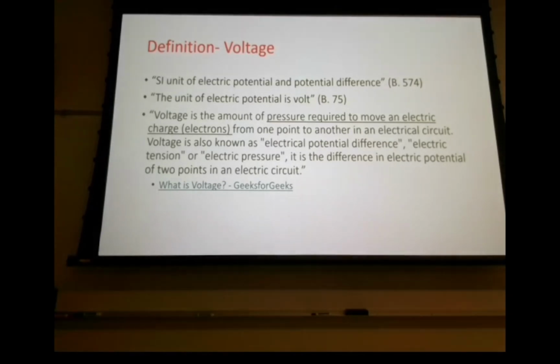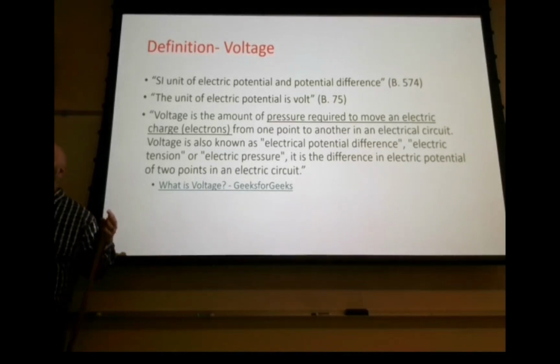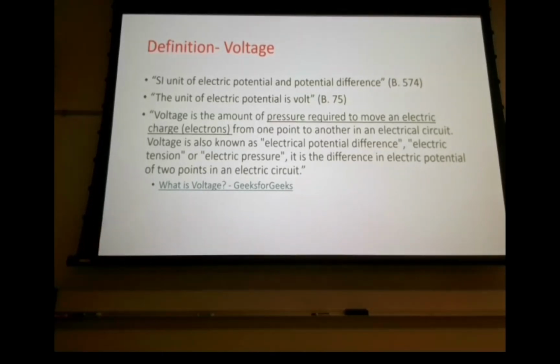So when you hit your exposure button, you take that space charge and you zip it across the X-ray tube really, really fast. That's the voltage that's causing it. So what we've got is the difference between the positive charge and the negative charge on the two electrodes inside of your X-ray tube. That will be your anode and your cathode. So you hit your exposure, you apply the kVp, those negative charges go up. The anode is, comparatively, positively charged. And the electrons move from cathode to anode really fast. Okay, so that's the job of the kVp.